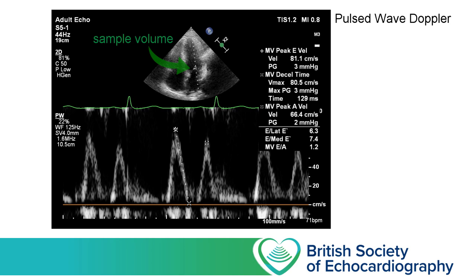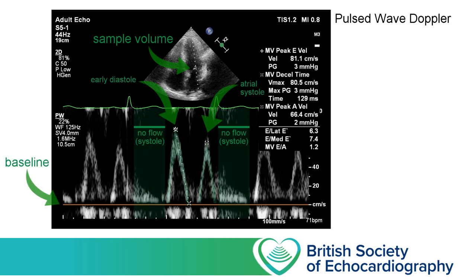Okay, so we're trying to demonstrate flow of blood from the left atrium towards the left ventricle — that is, blood flowing towards our transducer. The baseline has been placed at the bottom of the graph and we're looking at positive velocities. You can see that in systole there's no flow from LA to LV as we'd expect, whereas in diastole we have two discrete peaked triangles which represent two phases of LV filling — early diastole, and then atrial systole.